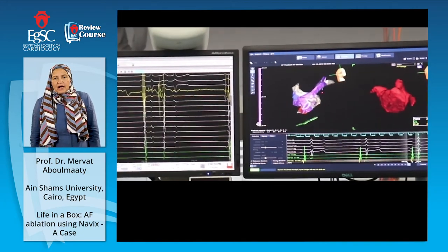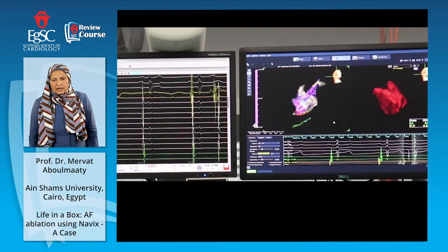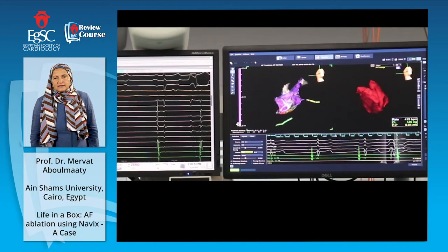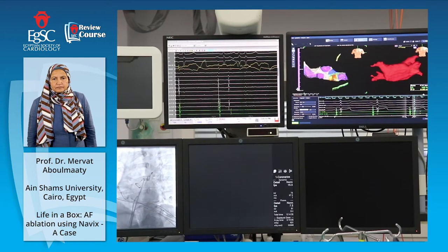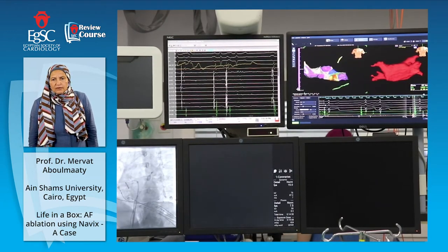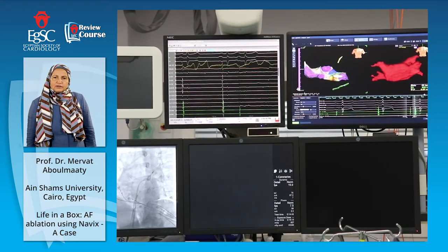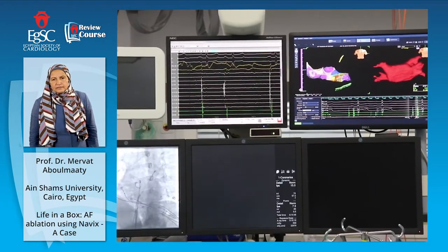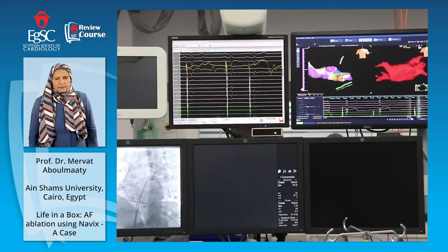I'm mapping, I'm collecting with the ablation catheter, moving into the shadow of the Navix, the 3D, moving both sides, the CT image and the virtual image. I'm now into the inferior vein, going again. Then I switch to the circular catheter to map the walls because it can get signals easily.